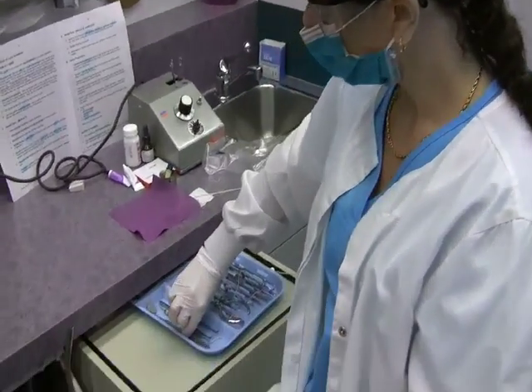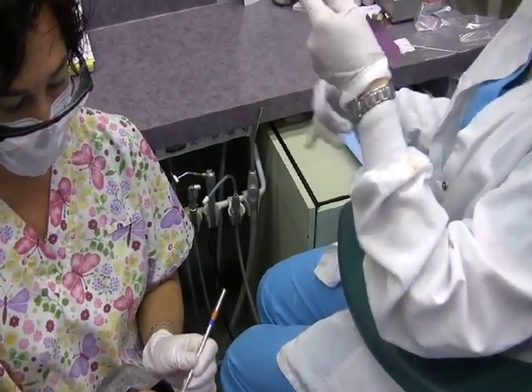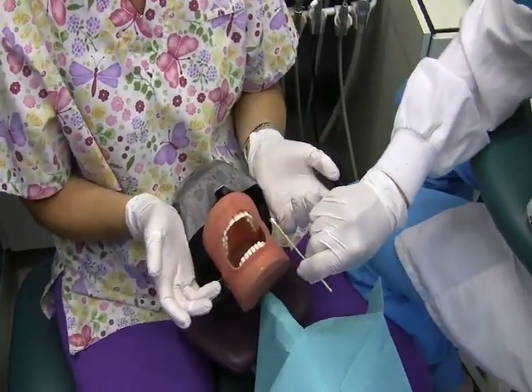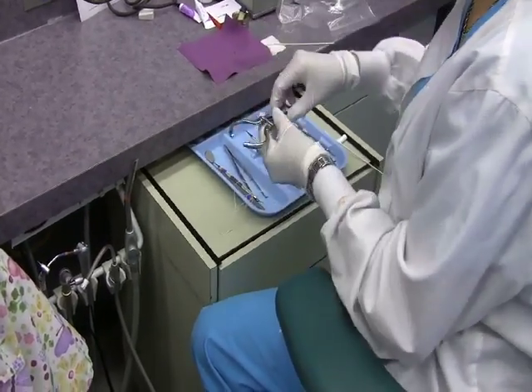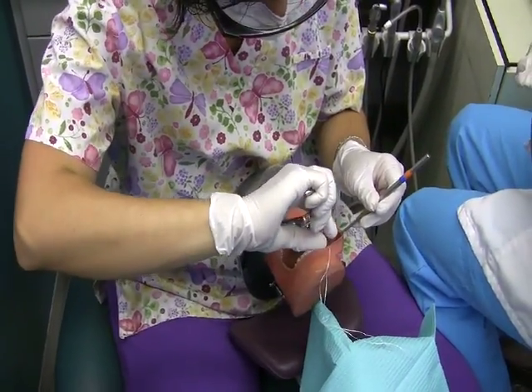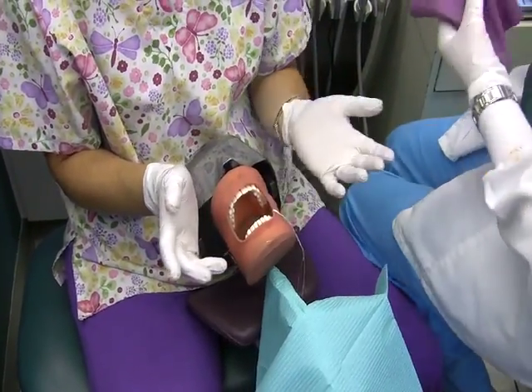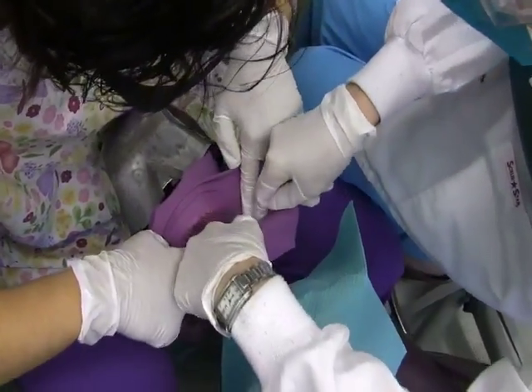Dental Dam Method 3. Placing the dental dam.